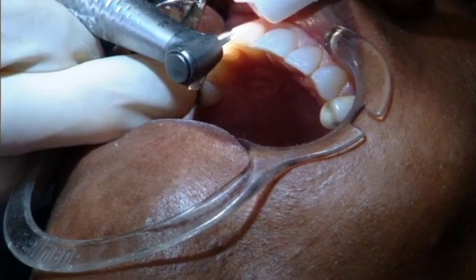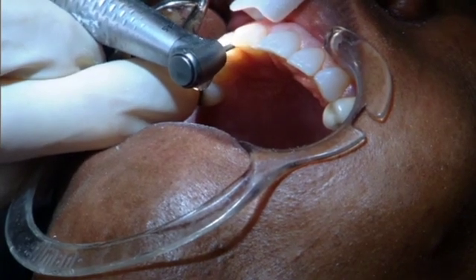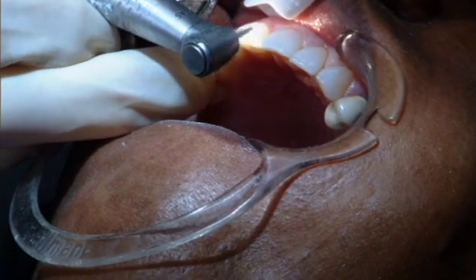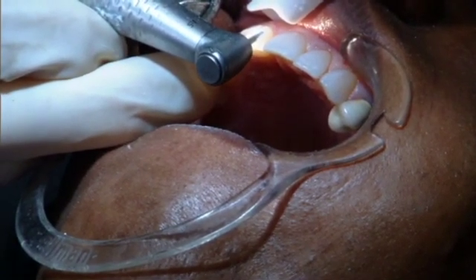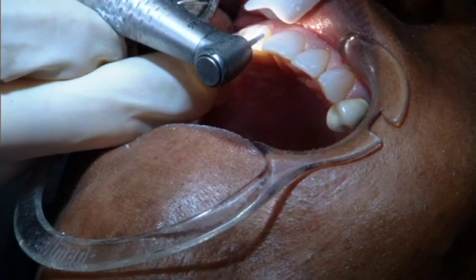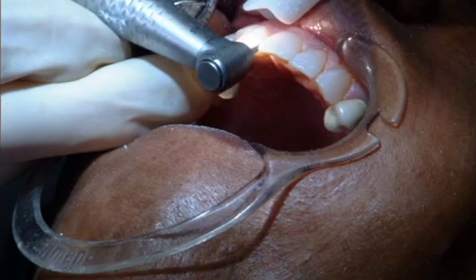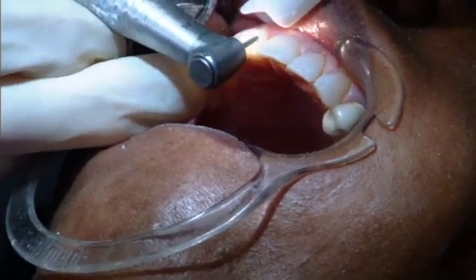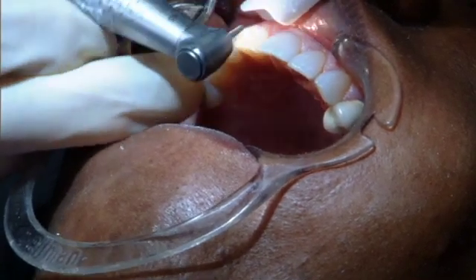I'll also break my contact with that burr. This will ensure that I give the lab two-plane reduction in the incisal 1/3, and we won't end up with headlights or opaque showing in our final crown and bridge.